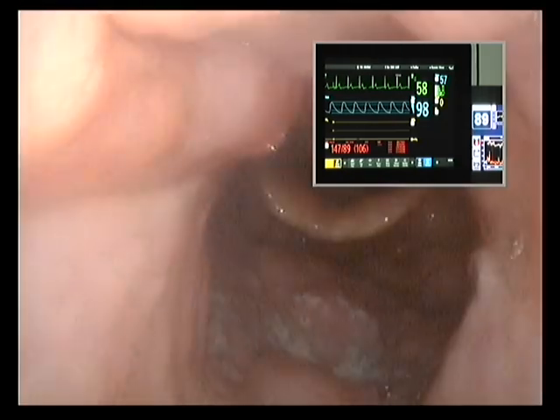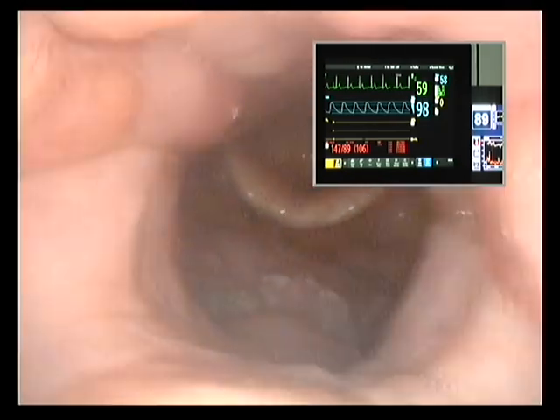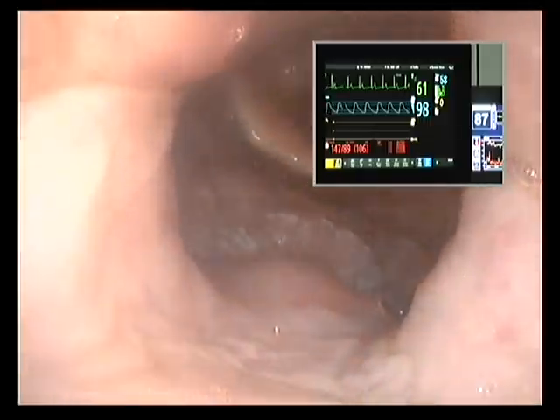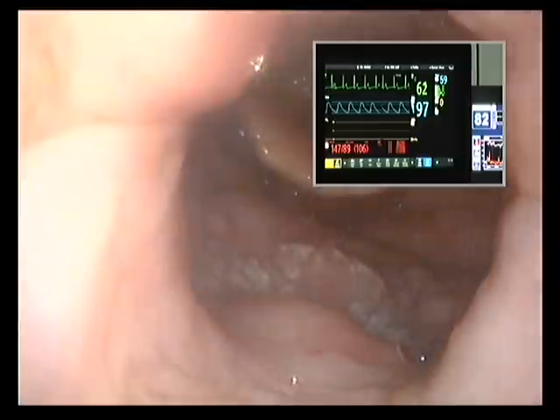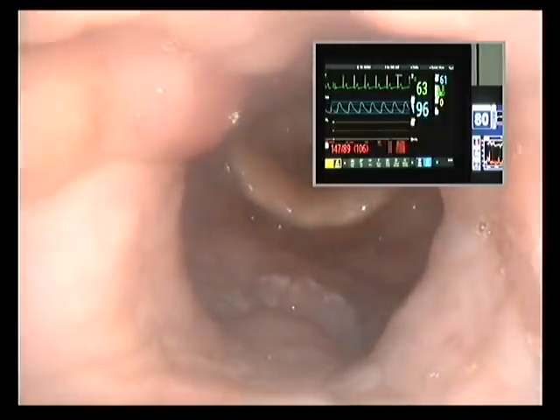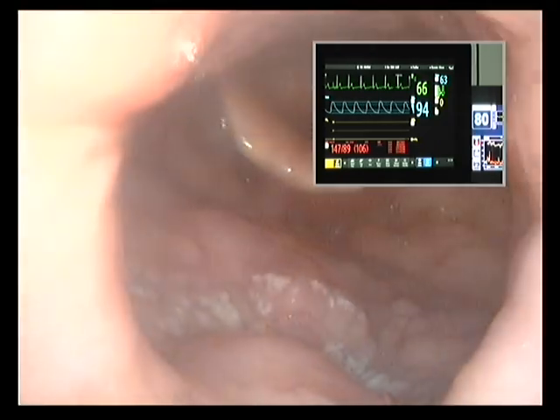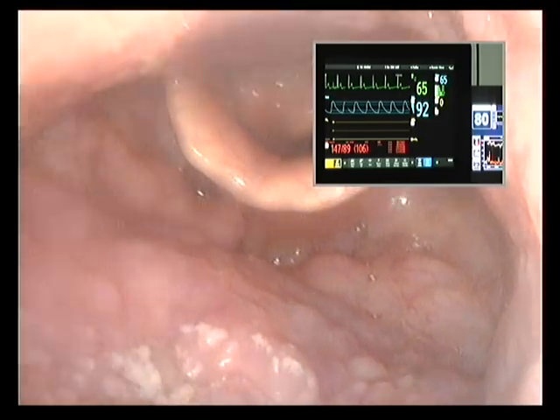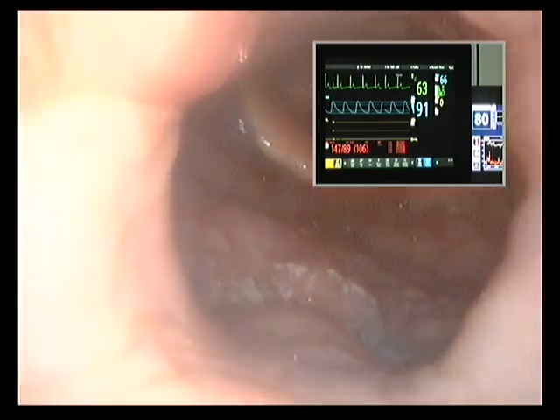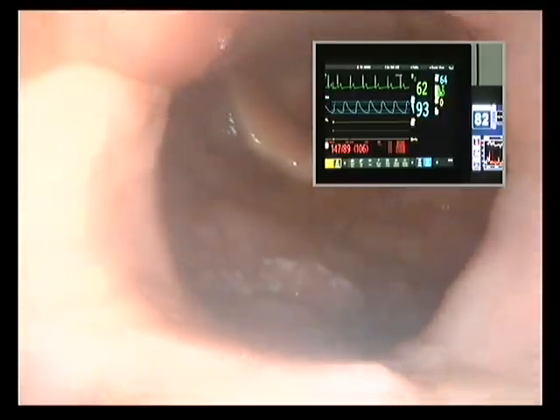As the BIS is approaching 80, the patient has started sleeping and snoring. The patient's complaints are daytime sleepiness and snoring, and here you can see a complete apnea happening. The airway tone is now reduced. That's the uvula, and this is the tonsil. The base of the uvula and the upper pole of the tonsil are the areas which actually collapse.